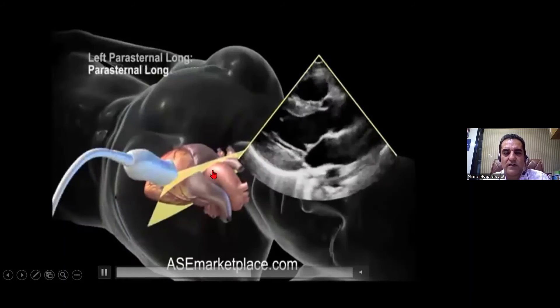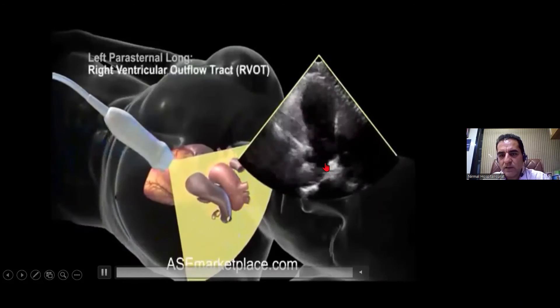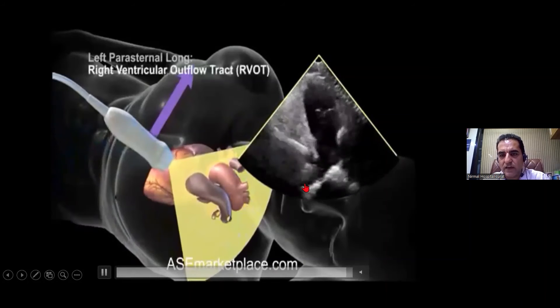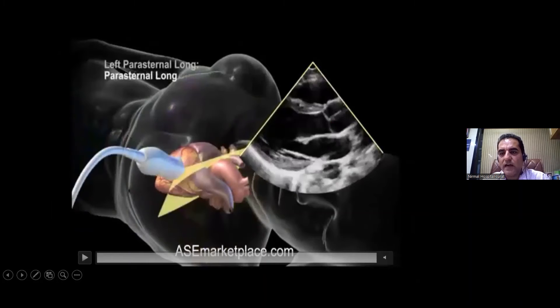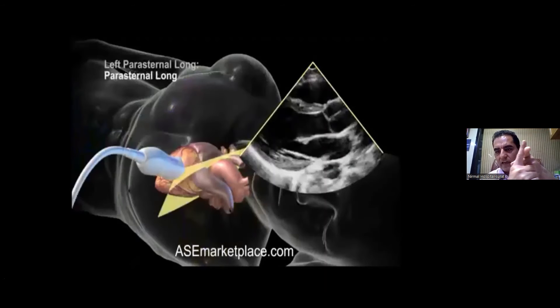Then coming back to the standard parasternal long axis view, we sweep upwards towards the head. You see a vessel coming from above downward at right angles to the aorta — that is your pulmonary artery, which divides into two. So when you sweep up, the aorta goes off and another vessel appears perpendicular to it. This sweep basically rules out TGA — transposition of great arteries — because if they are normal, both vessels lie in different planes at right angles to each other, so you won't see both vessels in the same view.